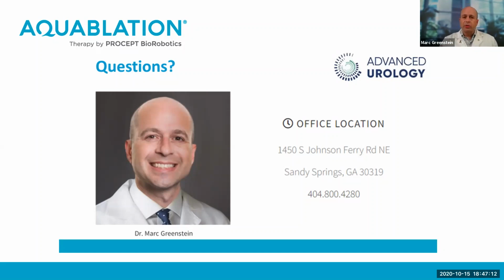Next question, hospital time. Like I mentioned before, everybody stays in the hospital overnight. It's just what we have to do. 1.6 days of hospital stay. So when we looked at our studies of our patients, 1.6 days of hospital stay was the average. In other words, almost everybody was going home the next day. Some people needed to stay an extra day because of nausea or sugar management or high blood pressure, or just they needed an extra day of irrigation. Sometimes that happens. Hopefully that answered your question.